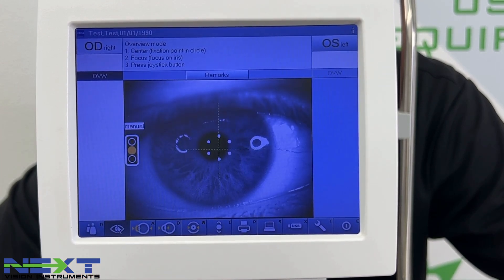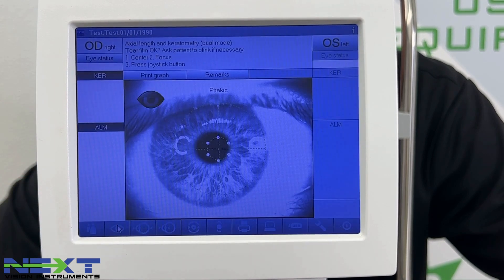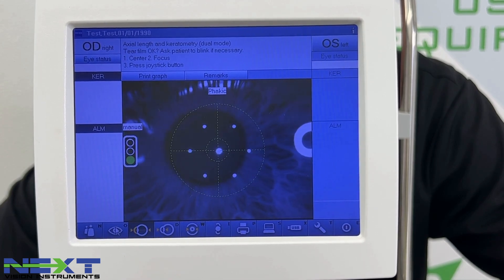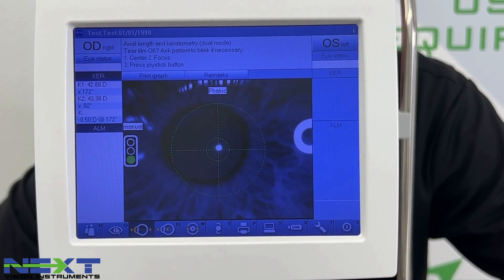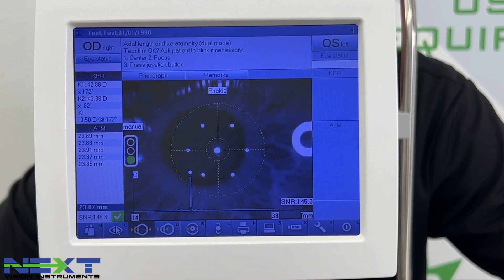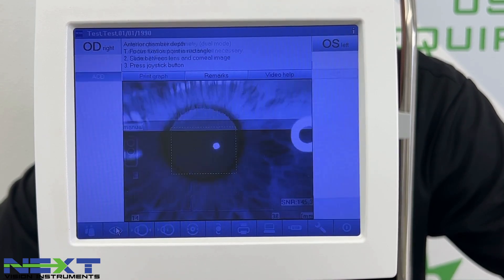With our test patient lined up, center them up using the arrows that guide you. Clear the light reflexes by pulling in or out until you get the green light, then click the joystick button. It will take K's — backing out until we get the green light — and then automatically proceed to axial length. It took three readings of the K's and averaged them, and five axial length measurements. You can continue clicking to capture more A-scans if desired.